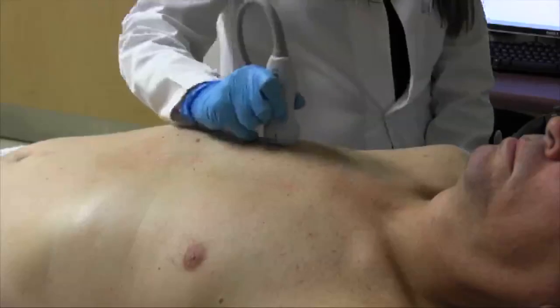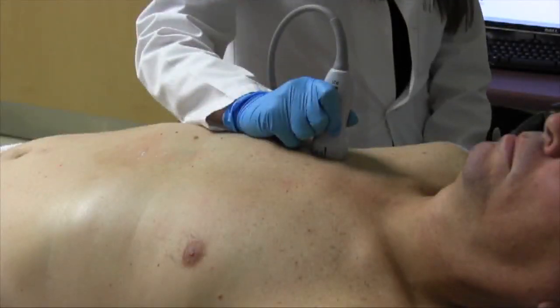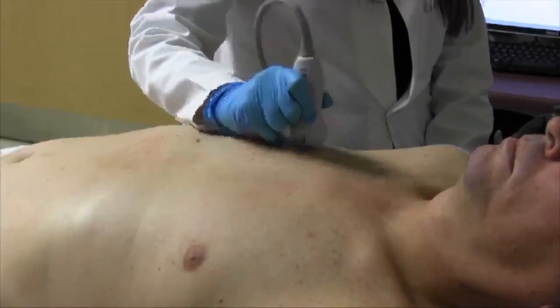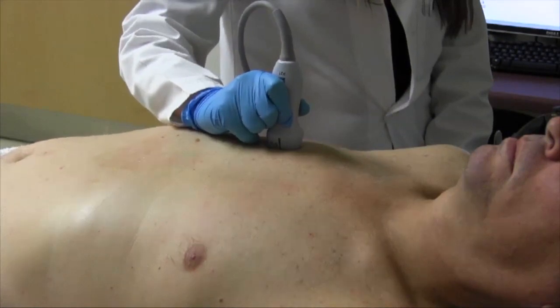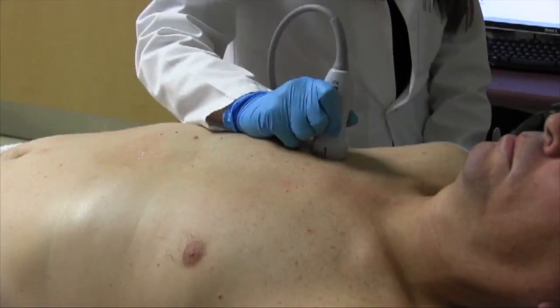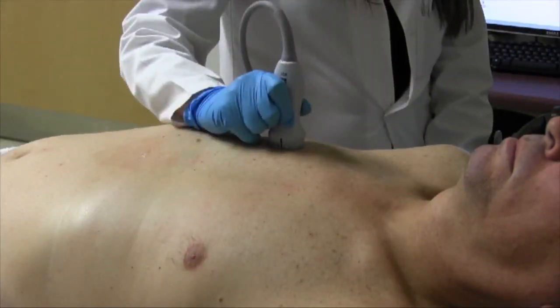This protocol is to be performed at 2 locations: the midclavicular line at the second to third or third to fourth intercostal space, and the midclavicular line at the fourth to fifth or fifth to sixth intercostal space. The same protocol and evaluation is repeated at the left anterior chest for a total of 4 locations of ultrasound imaging at the chest. An A-line predominant pattern is seen.